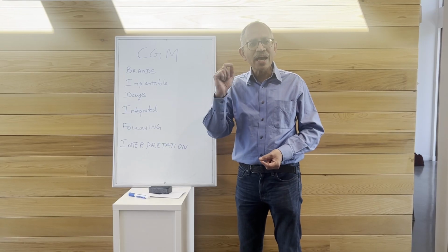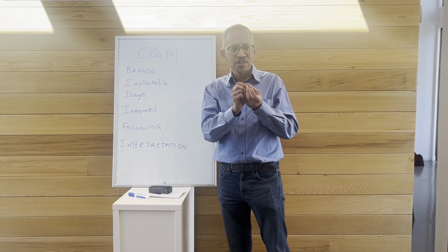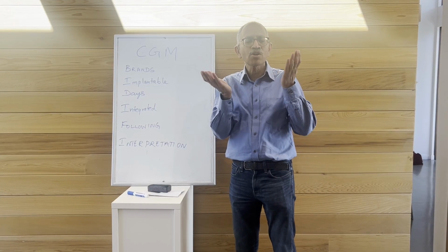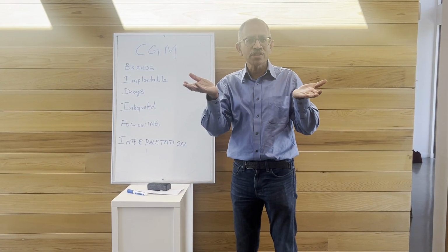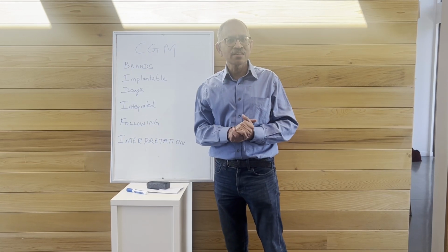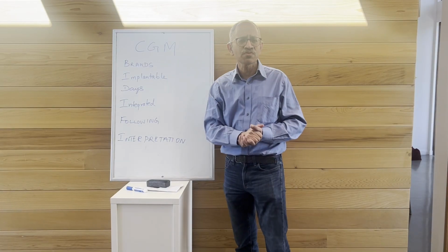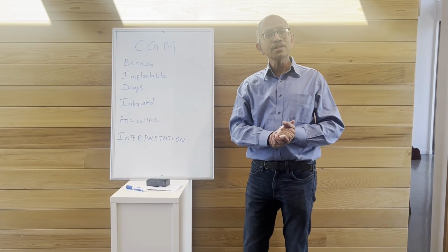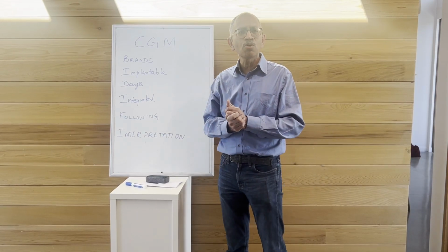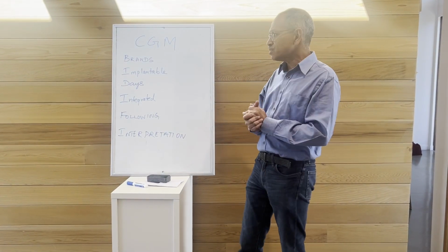So when you try to analyze, you need to remember there will be difference between the blood sugars and the interstitial fluid CGM. So it cannot be orange to orange, but more about data interpretation with the graphs which are created. There are several brands of CGMs which are available in the market. So your provider will let you know which one to go with and the reasons. Sometimes it might be the insurance company.